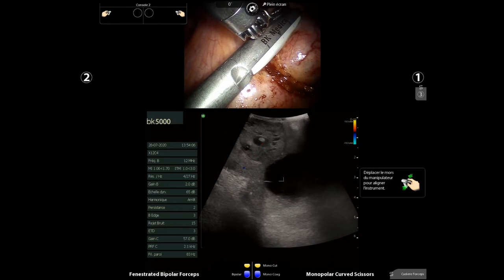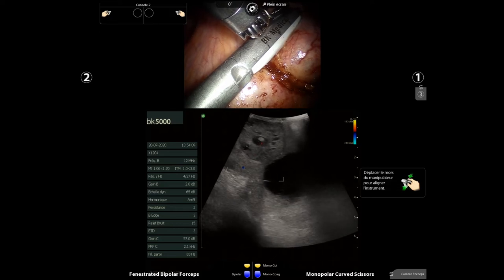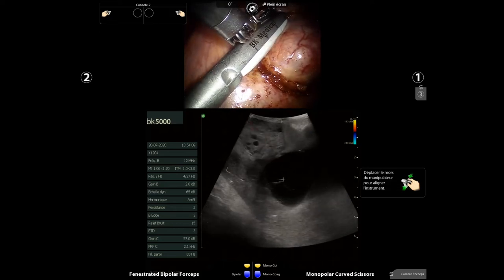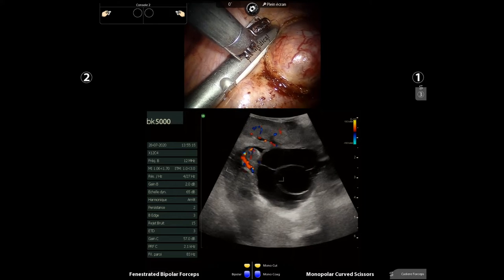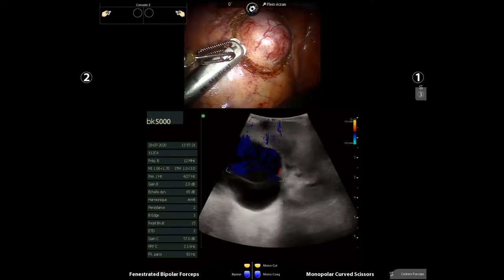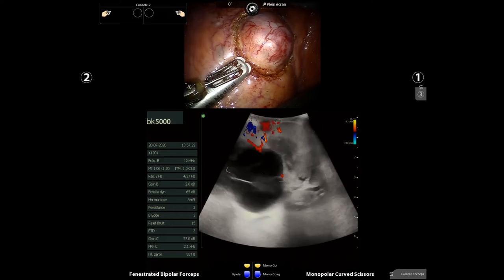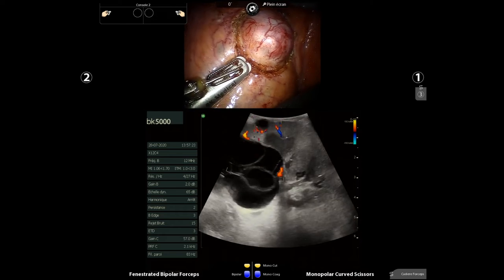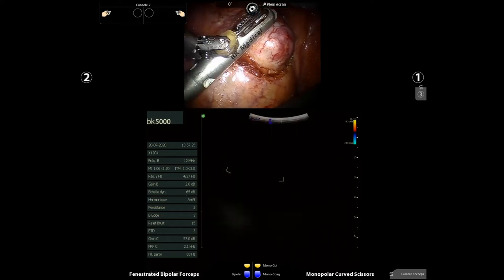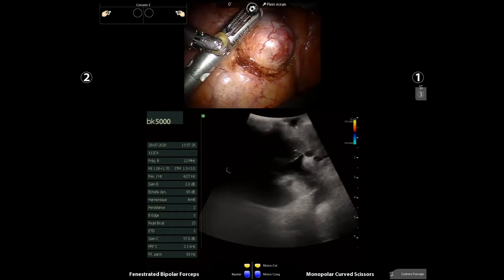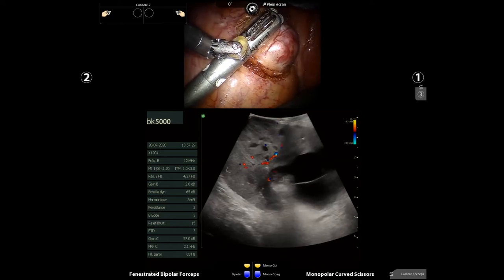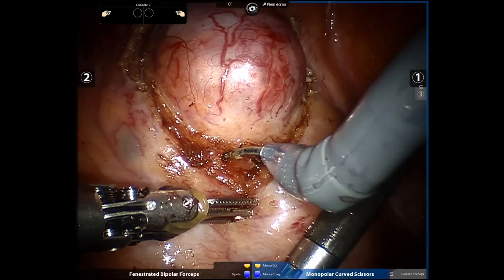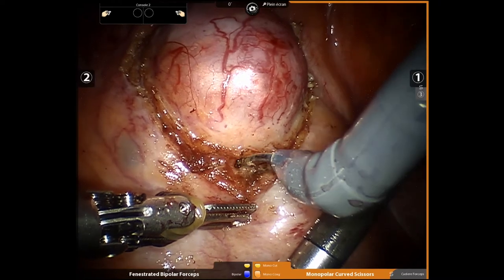Post-occlusive Doppler shows the absence of vascularization of the tumor, while the normal parenchyma is still vascularized. Partial nephrectomy can then start.